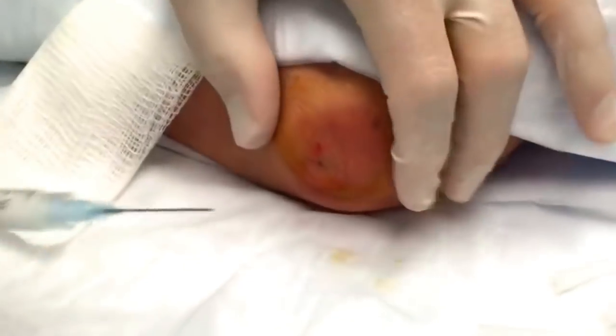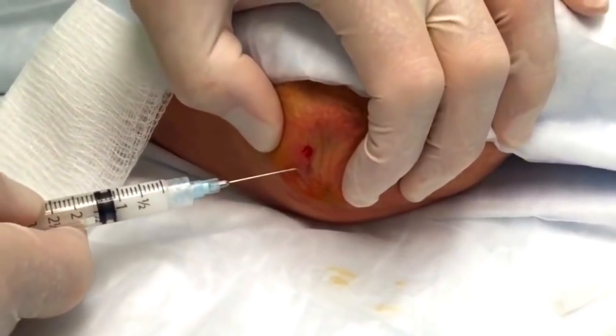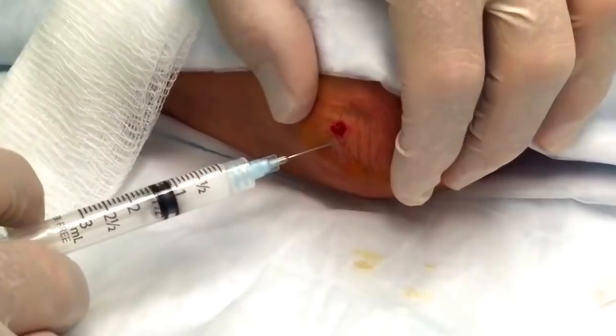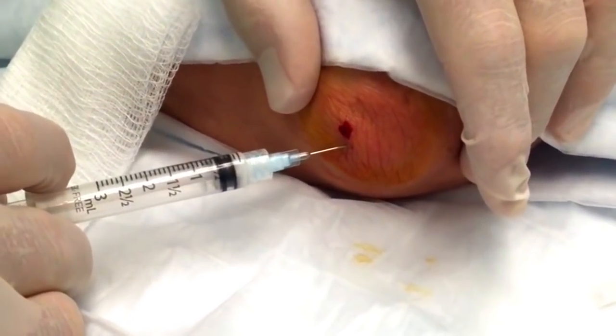Okay. All right, you're going to feel a little stick. I'm going to put just a little bit of cortisone in there for you now, okay? All right, you may feel a little stick on this one, but not much of one. You ready? Little stick. Was I right? Felt a little bit of a stick, but not real bad, right? All right, look at that.